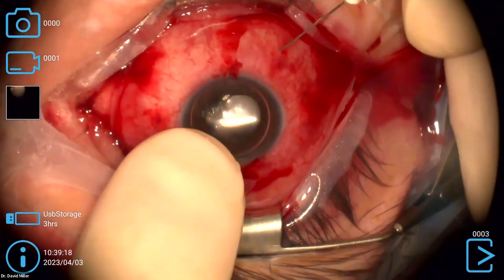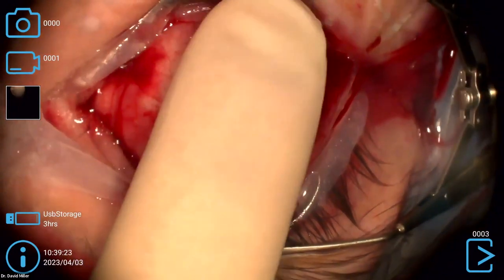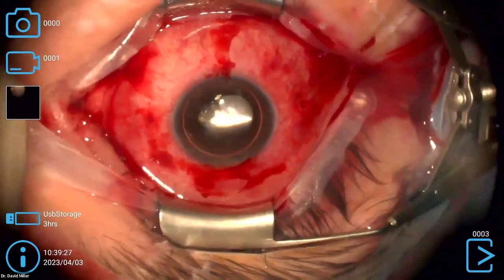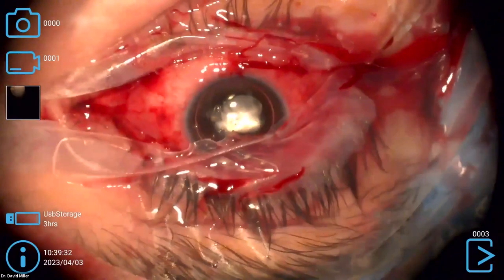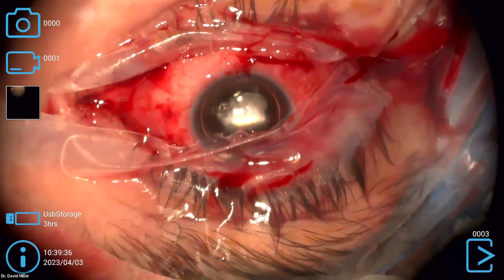And we won't have to be in here long. We just come down here. And that's it. That's all it took. Eric, we're getting you out. We got a gas bubble in the eye. I'm going to ask you to hold your head down for 2 days. That's all. Just like a macular hole case. Got it. It helps the macula smooth out.